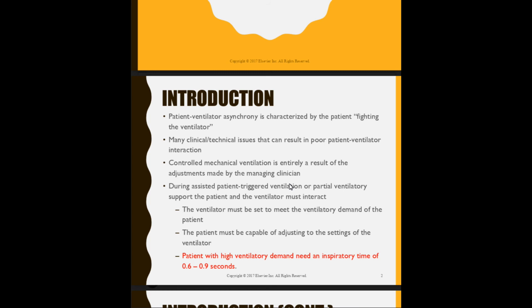And then once we've calculated the ideal body weight and the tidal volumes for this particular patient's height, then we normally go into our normal ranges for respiratory rate. And then we normally start with FiO2 at 40% to 60%, so in between there. And then our PEEP, normally it's either 0, +3, or +5. Most of the time we do +5 to mimic physiological PEEP. So that is our cookie cutter way of how we put people on the ventilator.